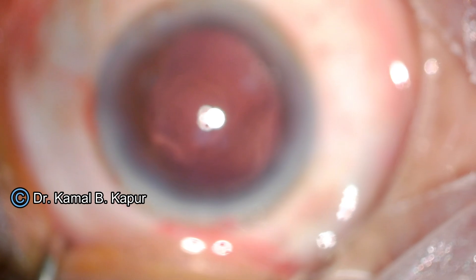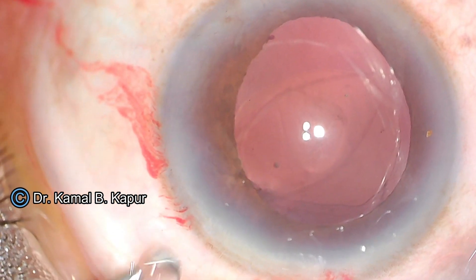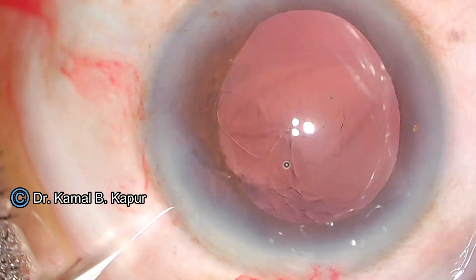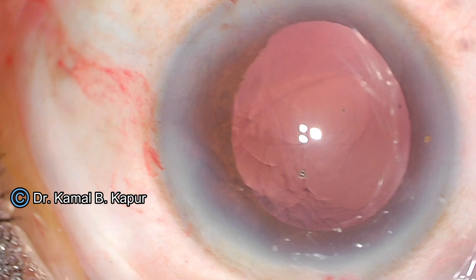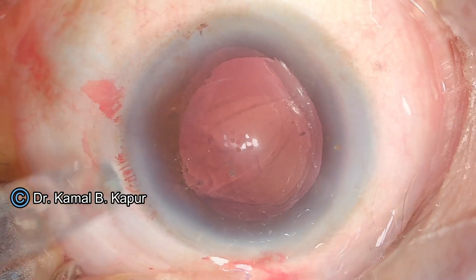Once vitrectomy is done, I proceed to put a minimal amount of viscoelastic into the anterior chamber, just behind the iris — enough to create a space between the iris and the anterior capsule. I am now putting a three-piece IOL manufactured by AuroLab India. I have no commercial interest. The trick here is to push in a very, very small amount of viscoelastic, otherwise it will go into the vitreous and may cause reactions, raised intraocular pressure, and a feeling of floaters for the patient.